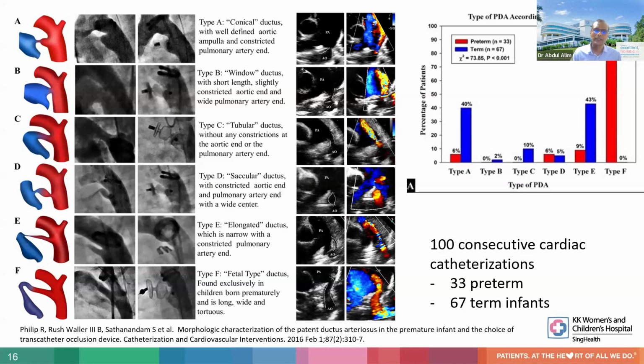We need to get a nice ductal view with the left pulmonary artery, right pulmonary artery, and aorta in the same frame. With a high resolution probe, if you get a good view, we can freeze that image and measure the PDA at the insertion at the pulmonary end.